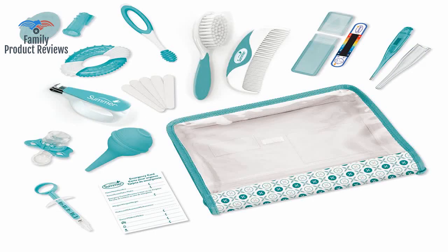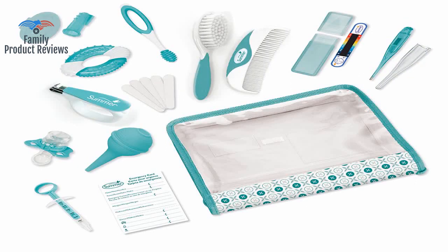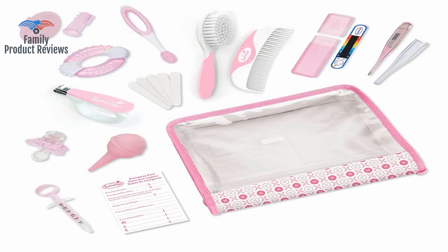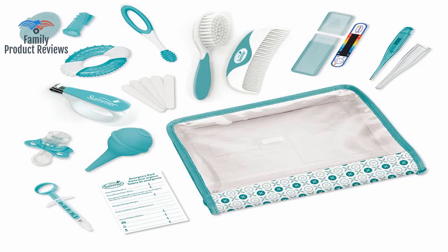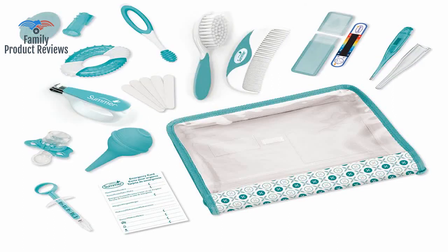It has all the basic health needs like digital thermometers and the kind you can lay on their forehead, gum massagers, and nail clippers. Lots of great stuff in here along with emergency contact forms for when you leave your little one with a sitter. The bag it comes in is also nice for keeping the baby's things together.